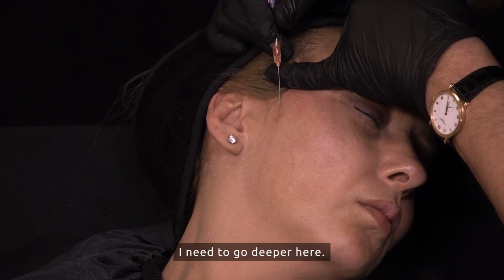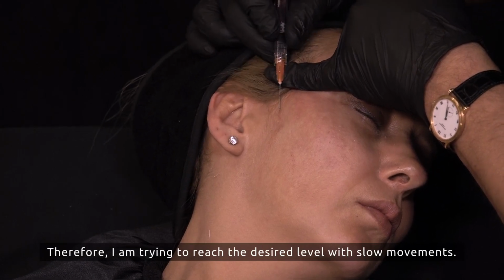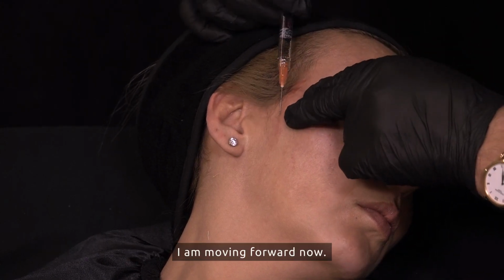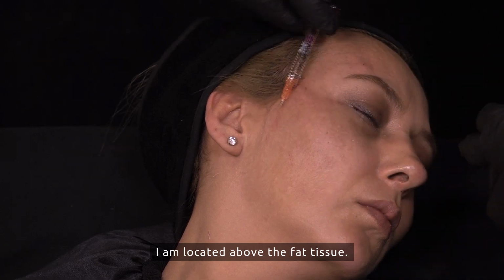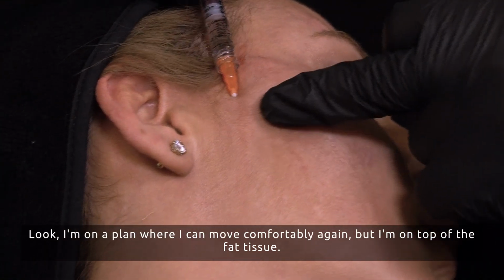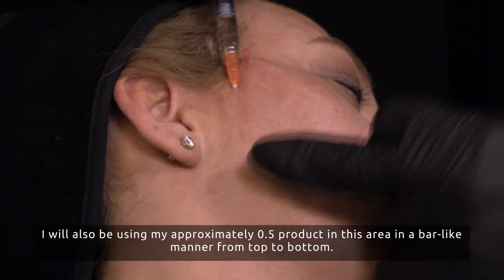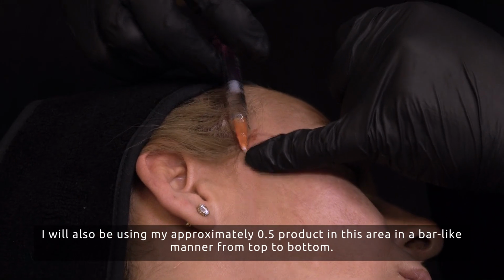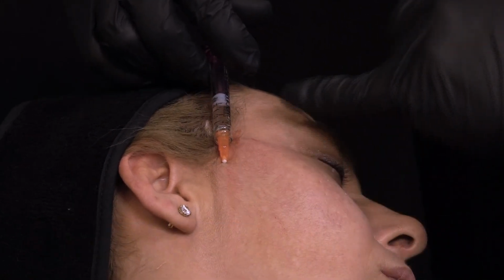I need to go deeper here. Therefore, I am trying to reach the desired level with slow movements. I am moving forward now. I am located above the fat tissue. Look, I'm on a plane where I can move comfortably again, but I'm on top of the fat tissue. I will also be using approximately 0.5 of product in this area in a bar-like manner from top to bottom.